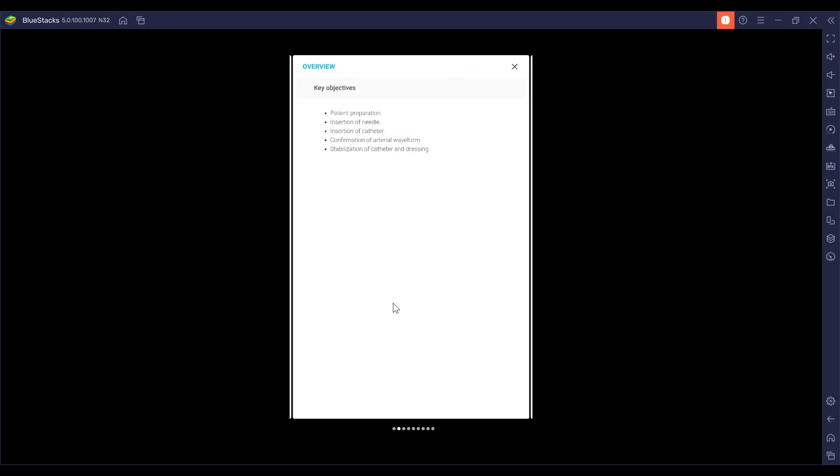The key objectives are patient preparation, the insertion of the needle, insertion of the catheter, confirmation of arterial waveform, and stabilization of the catheter and dressing.